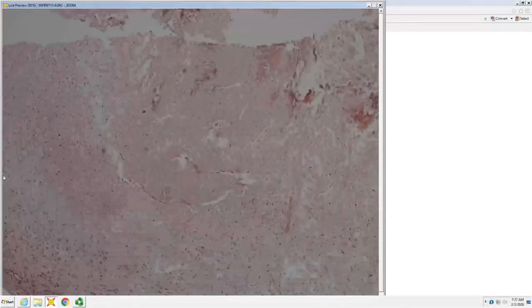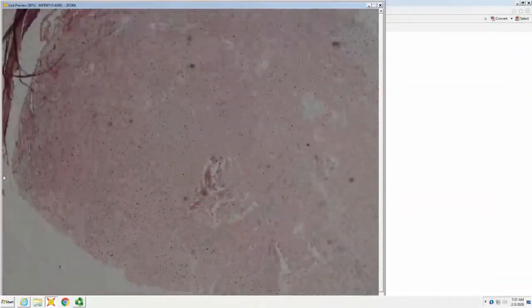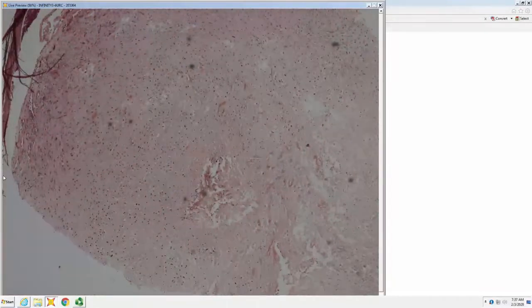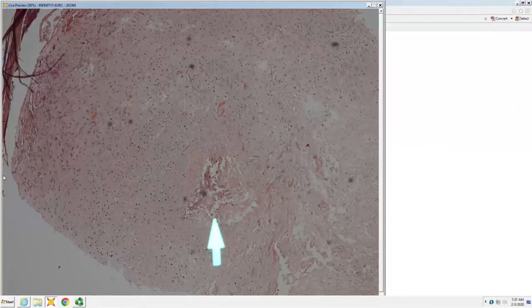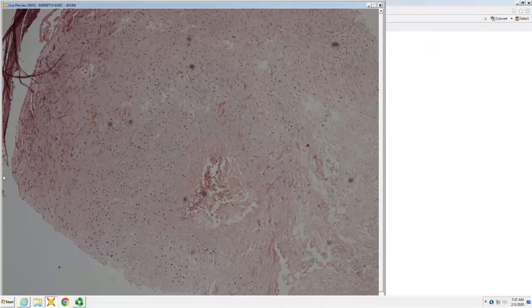Another that you might see, and the fellows certainly have to recognize. You have, in this case, what looks almost like cartilage, and attempts at bone formation, but it's bad, lacy bone. Those are the sorts of things you can see in an osteosarcoma, and then often areas of necrosis as well.